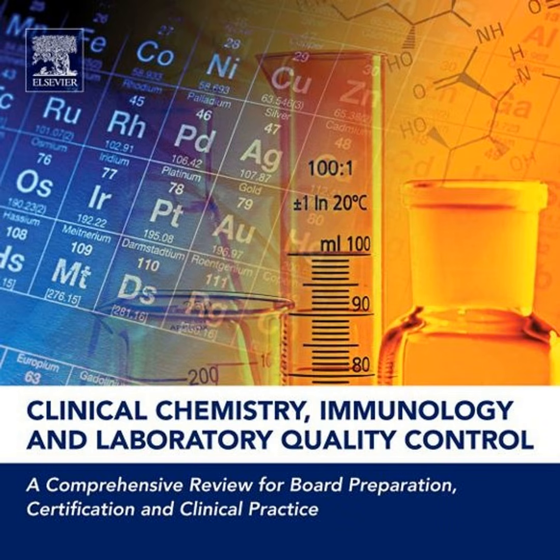And people go to extraordinary lengths to cheat these tests. They do. While routine integrity tests check for pH, creatinine, and specific gravity, sophisticated internet adulterants, potassium nitrite, glutaraldehyde, stealth, are designed to chemically interfere with the metabolites. And routine tests can't detect those. They often can't. You need specialized dipsticks like Adultacheck for detection.